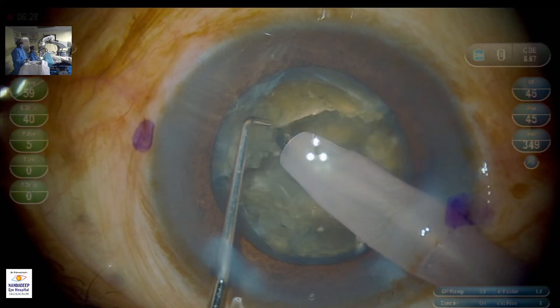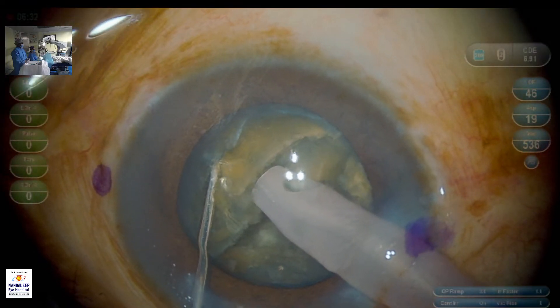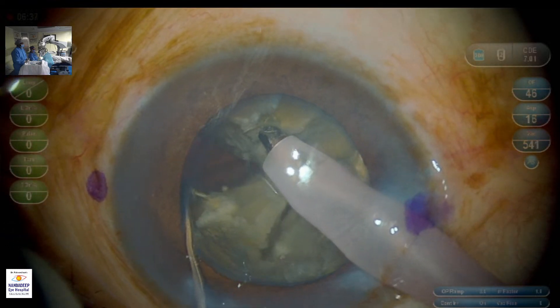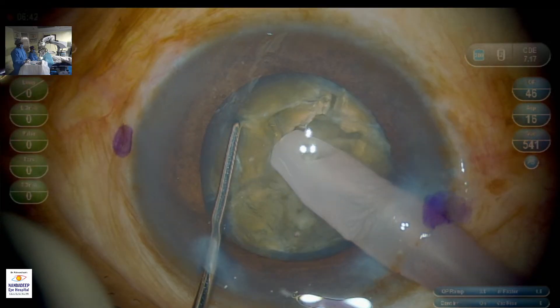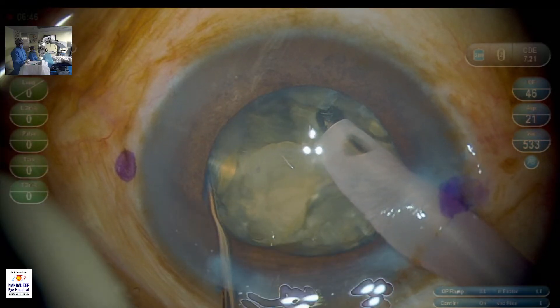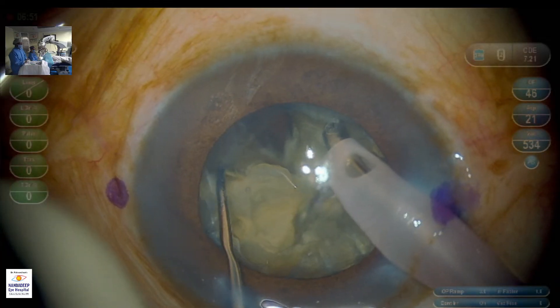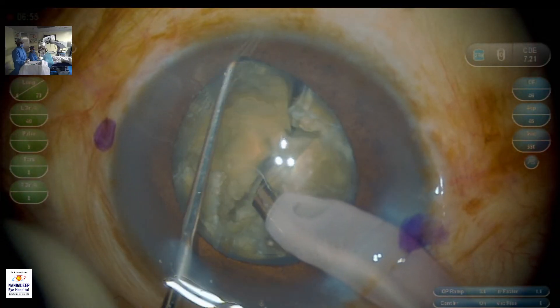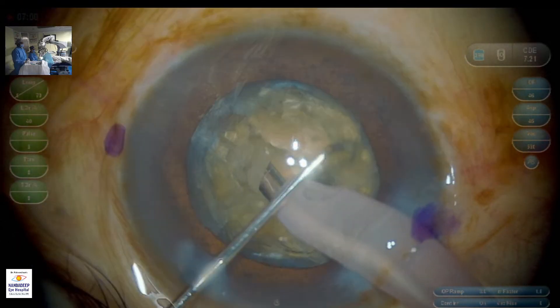Now the nucleus is being sucked into smaller fragments. A one-level chop has been done and the posterior blade has been flipped. The same is being repeated. One hemi-nucleus has been divided into three pieces. Now we are proceeding with the other half.